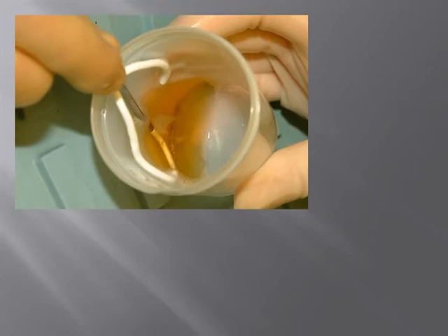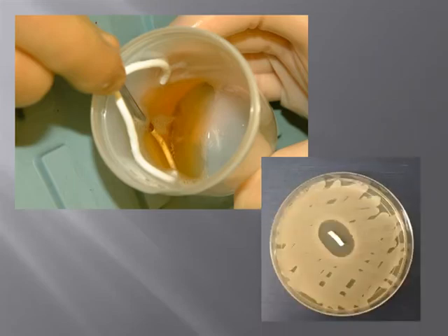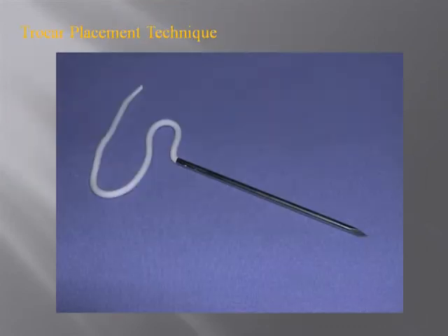At the time of surgical placement, I always soak them in an antibiotic solution, which I feel is important. I have really demonstrated that over the years by doing testing of the importance of that, and here we see an example in a petri dish of an Advanta implant which has been soaked just for a minute in antibiotics, and we can see the tremendous resistance to surrounding Staphylococcus bacteria.